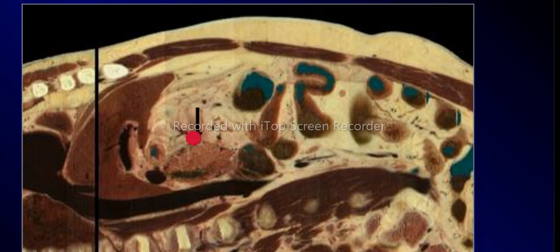So we are continuing towards the midline. At this stage, we are beginning to see the spine. These are the muscles of the back. And here we have your IVC, inferior vena cava, emptying into the heart. You can see that your liver tissue is getting smaller. This is pancreatic head beginning to show.